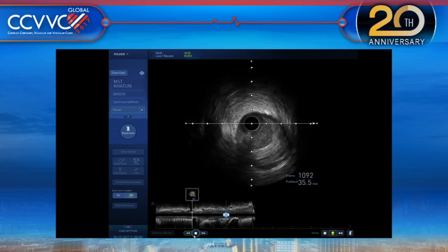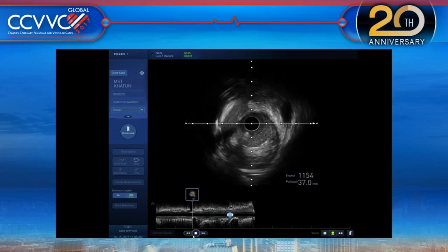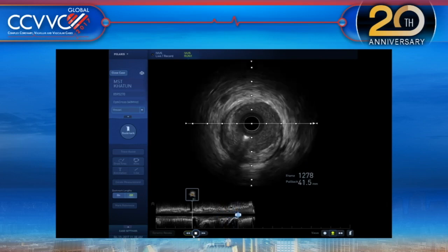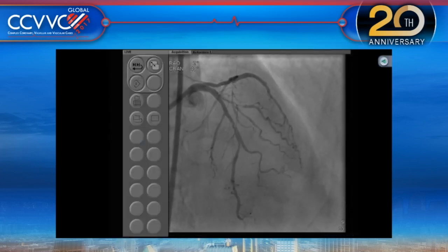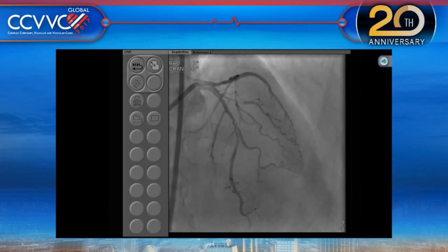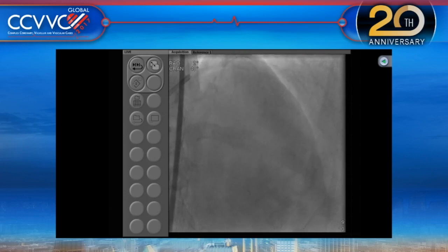So before you go, I know you're choosing. Again, it's another bifurcation calcific lesion. But the question of whether or not we need rotational atherectomy, or what about orbital atherectomy in a case like this, is something to be talked about. We have a great panel. New to the panel are John Fox, Cindy Grimes, Stefan Windecker. Who else am I missing?